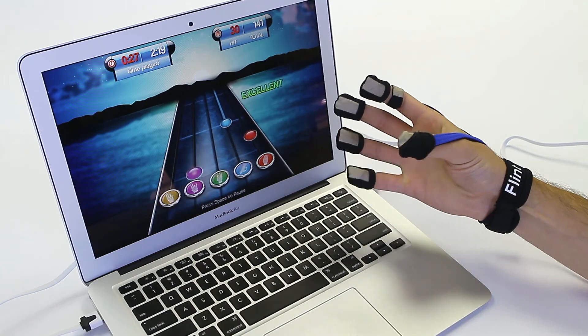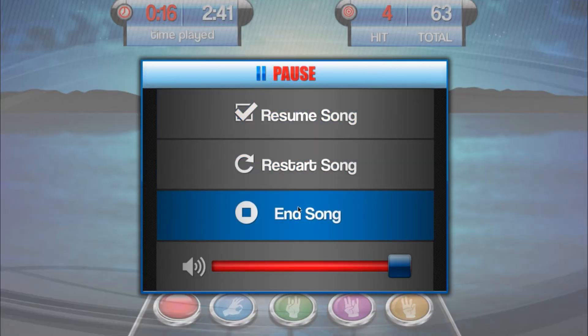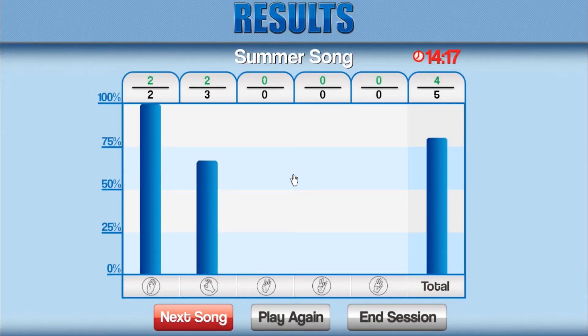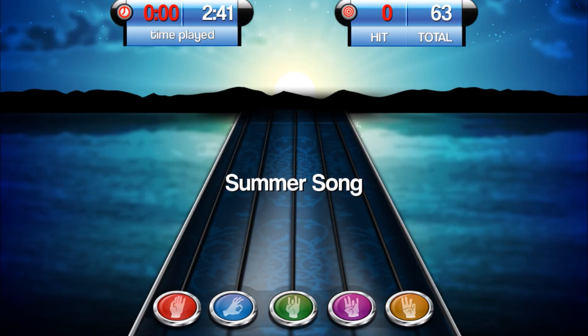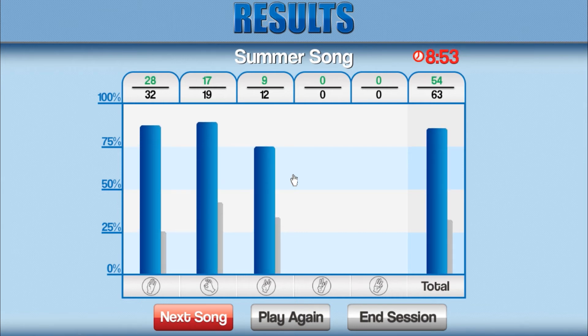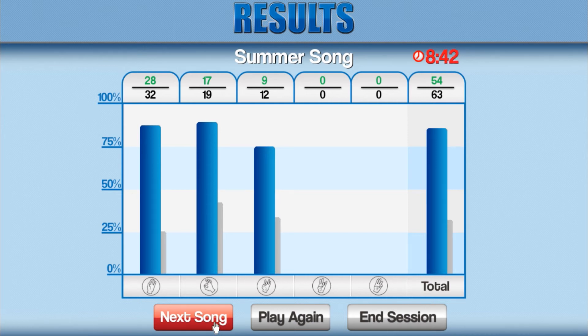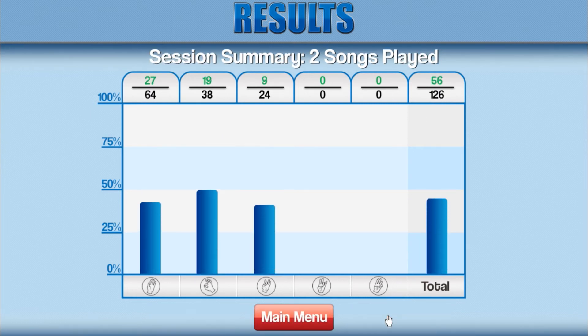Press the space bar to pause the game. In this menu, you can restart the song or end the song early. After a song has completed, your performance for each individual grip and total performance is displayed. Select Play Again to repeat the previous song. After you play the song twice, grey bars will appear representing your performance on the previous try, and you will be able to select Next Song to go to the next song in the playlist. The clock in the top right corner displays the time remaining in the session.